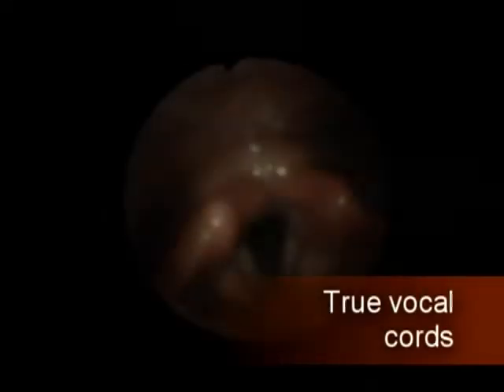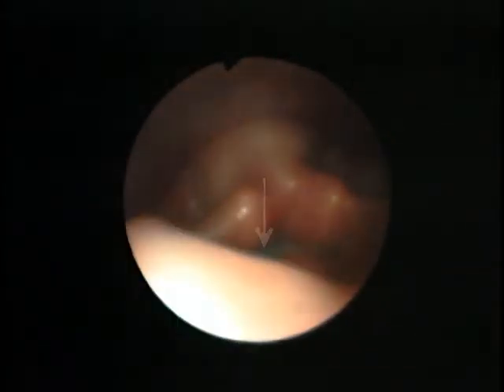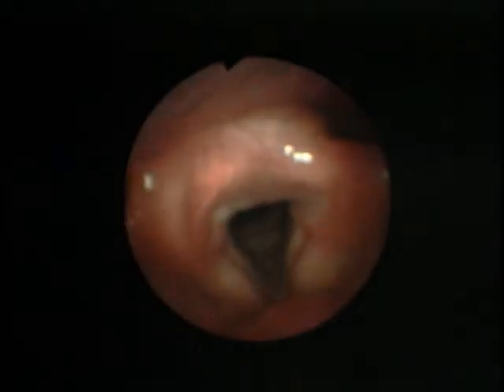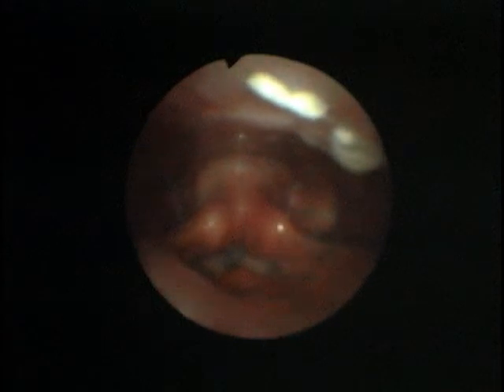Here, inspect the true cords and false cords and the overlying soft tissue of the laryngeal cartilage. Also inspect the piriform sinuses on either side of the larynx. The vocal cord movement and symmetry are important to document. At this point, asking the patient to say ah and ee allows the clinician to document cord function.